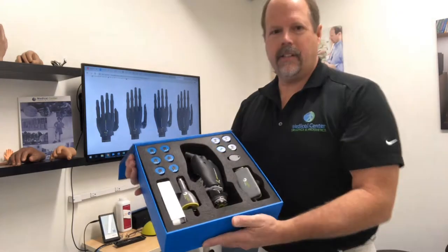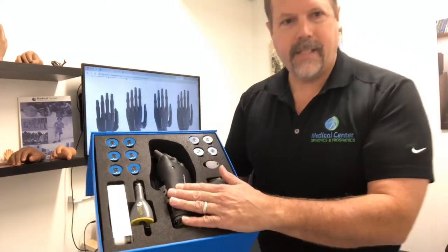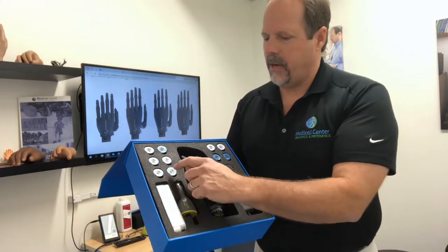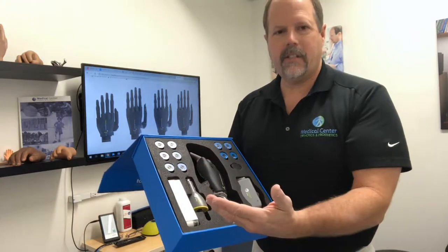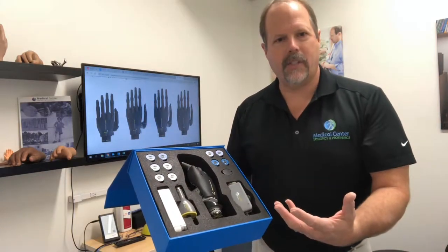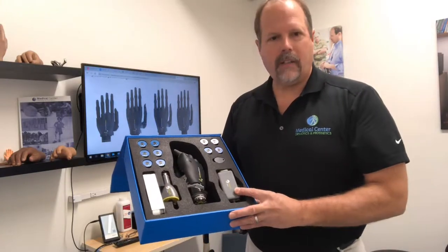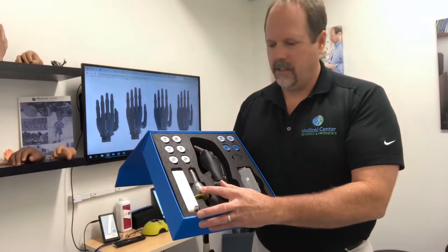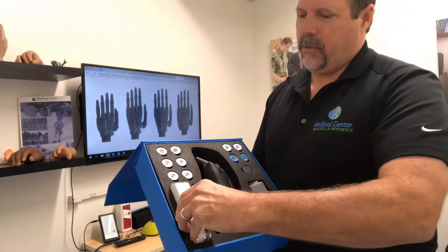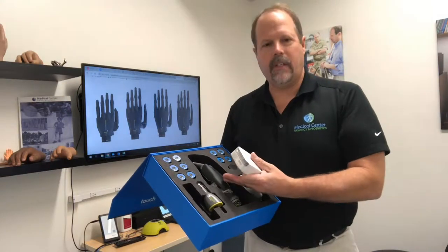What we have inside here is some nice things. First, we have the Touch Bionics iLimb Quantum Titanium — this is probably the most advanced hand on the market currently. We also have these grip chips, which are Bluetooth-emitting devices that patients can put in their environment. As they wave the hand over, it will automatically change the hand position for the patient. We also have a wall outlet charger, a car charger, and this device comes with a nice little iPod so patients can program or download the app from Touch Bionics and see quite a few things from the hand.